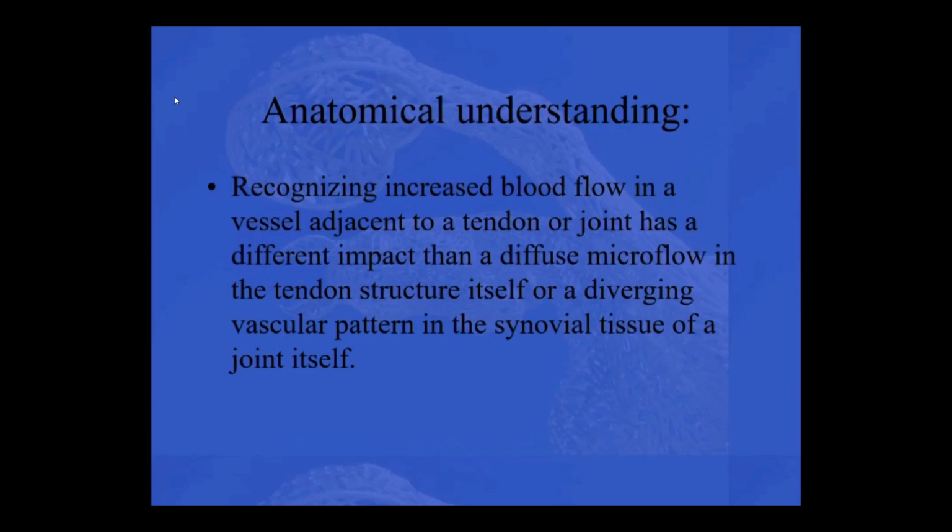You see that again, knowing your structures, knowing your joint structures, where the blood vessels are located in your synovial membrane or close to the synovial membrane in your joint, that helps a lot. So sometimes it's very interesting to go back to the anatomy books and look at that part that before I started doing Doppler was not that common to me. I was more interested in the musculoskeletal structures than really the vascular structures.